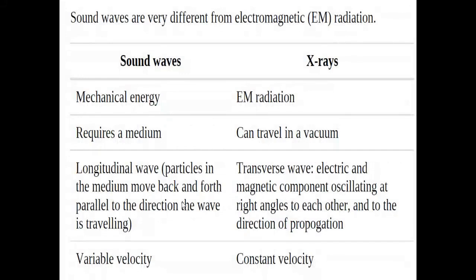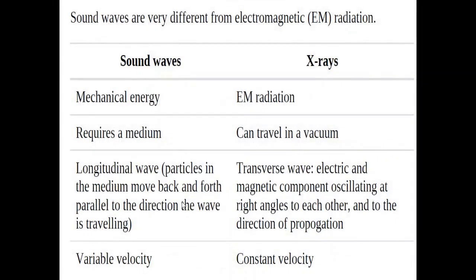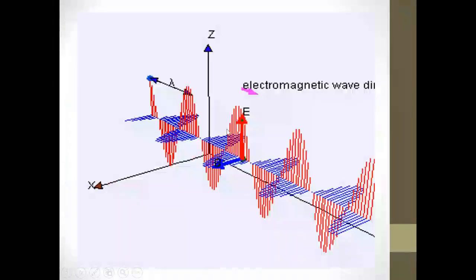On the other hand, ultrasound waves are different. They are mechanical energy and their speed is mechanical. The speed of waves depends on the medium, meaning their speeds in water are different from their speeds in fat, different from their speeds in soft tissue, different from their speeds in bone, and also different from their speeds in air. This is because it heavily depends on the particles present in the medium.